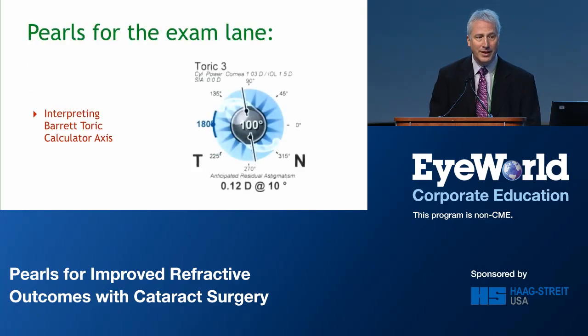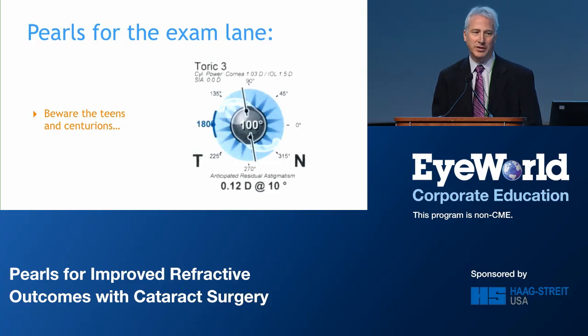There's a couple other things I want to call your attention to, and these are from mistakes that I have made. Yes, indeed. So if we look at this, this is what I like to call beware of the teens and the centurions, okay? So look at this. We've got an axis of 100 degrees, and there's a little bit left over at 10 degrees. 110 looks pretty similar. That's a flip, right?